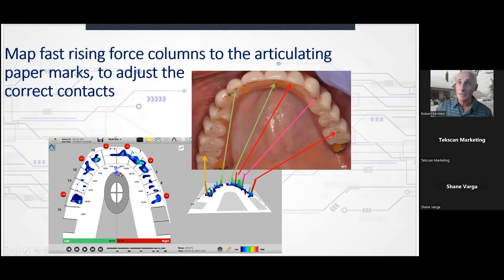And these through here, you don't have to touch. So everything distal between here and here, you don't have to touch. That's all of these, right? And then you make another recording after you adjust all of these uneven rises, and you do the same process.